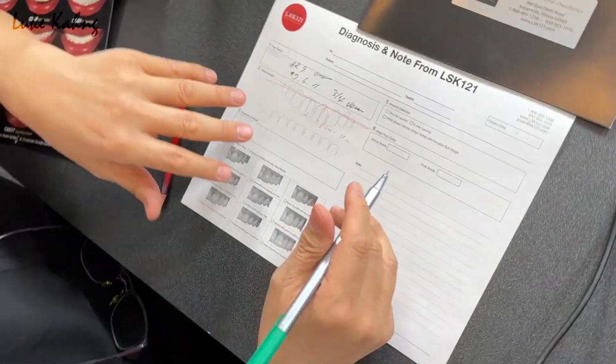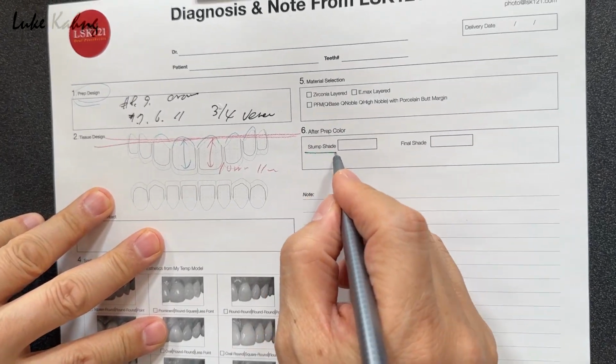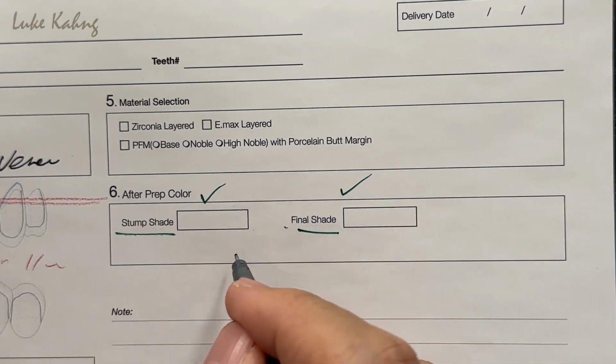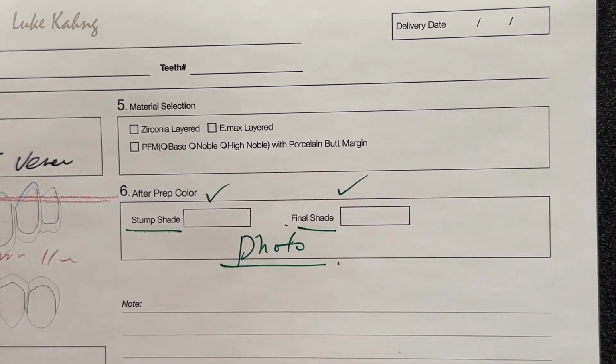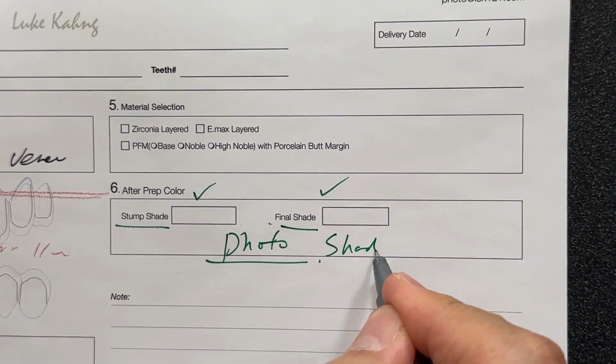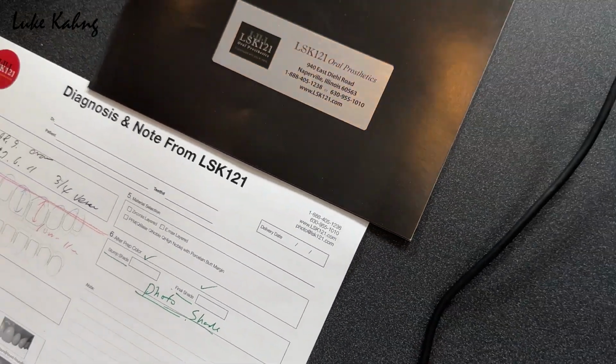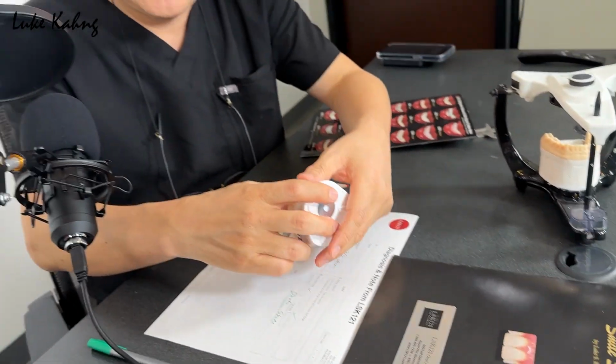And another very important stage is the after-prep color. Stump color, final shade, is very imperative, so you have to give it to me. A photo is the best. And with the shade tab, any shade tab you can use, then we can change it, especially when I don't have any room. And then I can explain here.